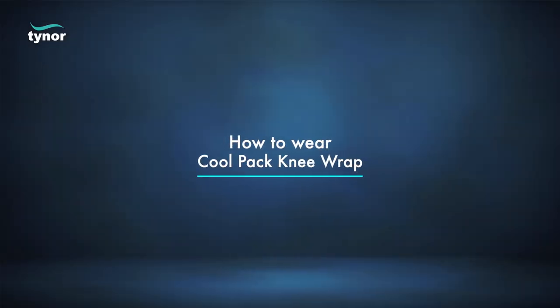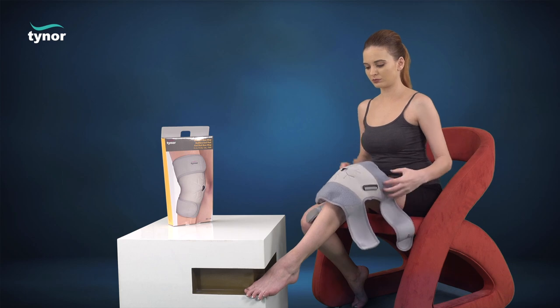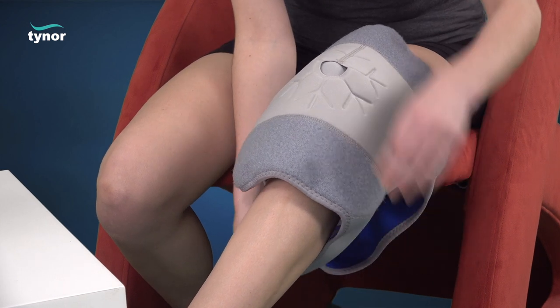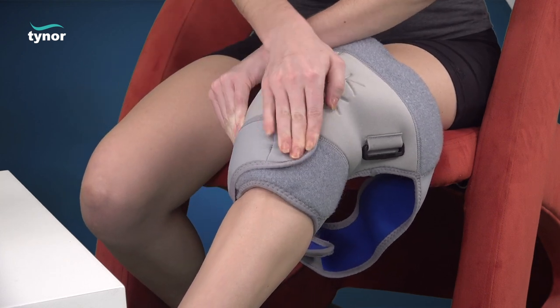Now let us see how to wear the cool pack knee wrap. Apply the product with the wider side placed upwards. Adjust the fabric cover to align the patella with the patellar opening in front. Close the hook-loop fasteners on the fabric from bottom to top.